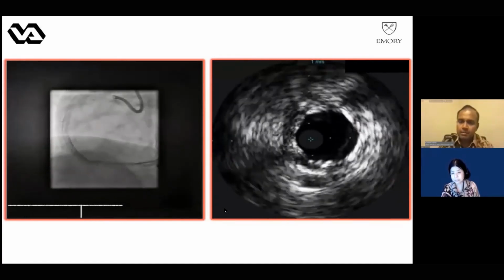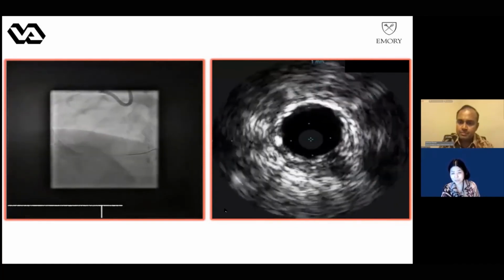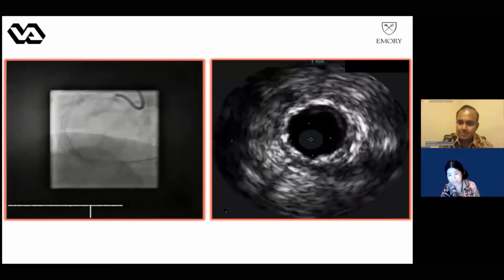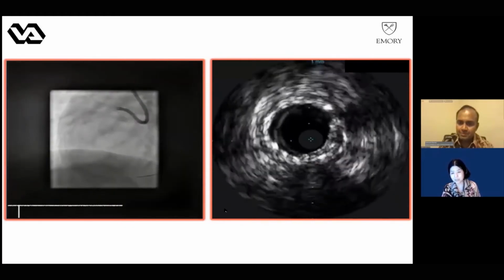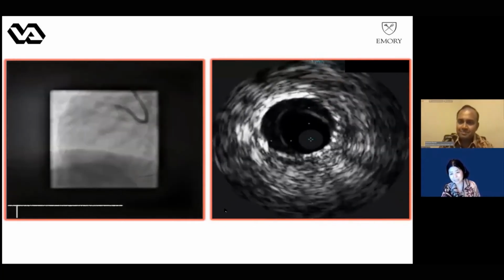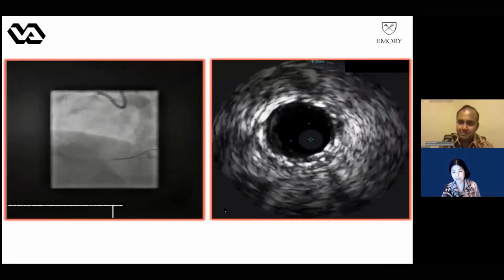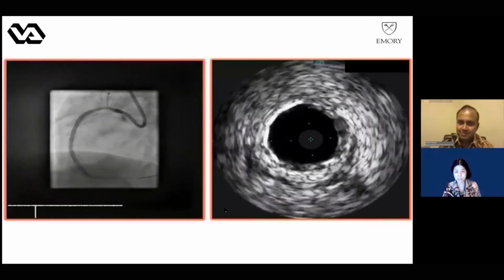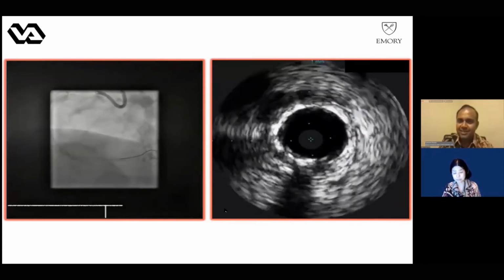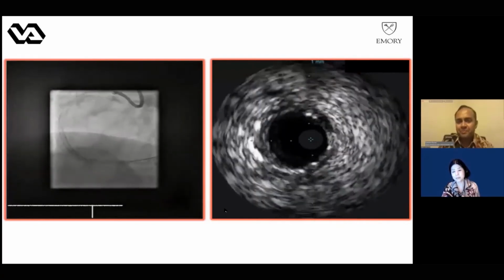And then you see the old stent, but there is no explanation at all. You see the stent was super underexpanded in this place. You remember the double layer of the strut and also the calcium behind. And now it is almost over 7-8 square millimeters, which is, wow. So we have done good there. Yeah, I think there's not much to explain. It's just good expansion.